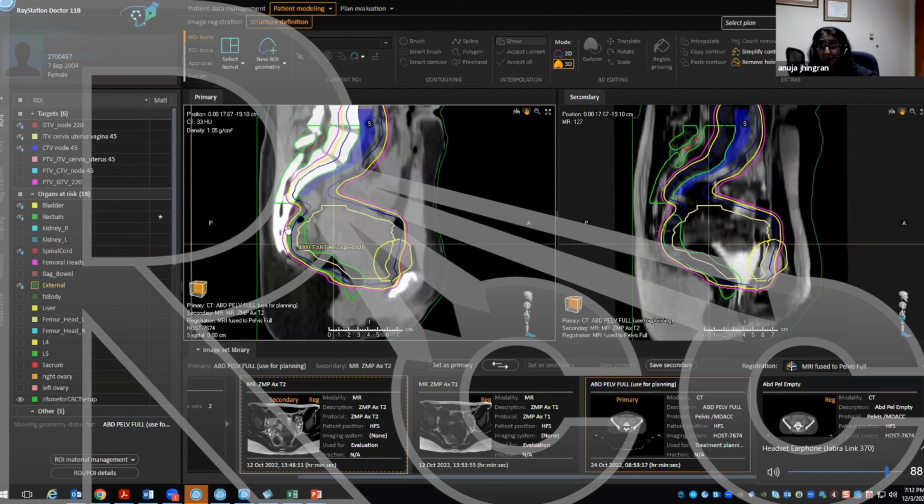Unfortunately, in this case, she actually had an amazing response, but her uterus really was stuck there, right? And it didn't rotate. And if it didn't, you can treat it, but you got to be very careful about that dose to the sigmoid and the rectum, and the sacrum. But you really should first try to see if you can rotate it. In most cases you can, but in her case we couldn't, right? In most cases you can, but some you can't. And if you can't, then you do keep it backwards and then you treat.